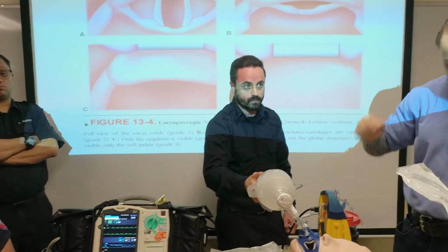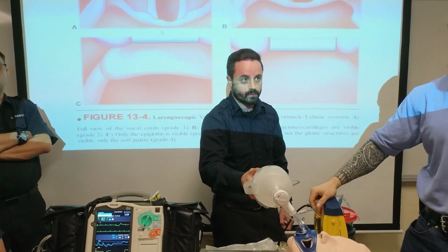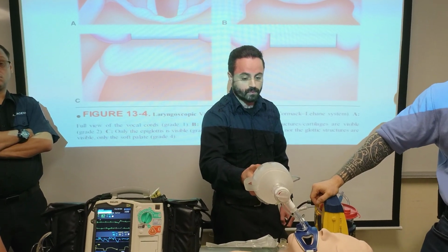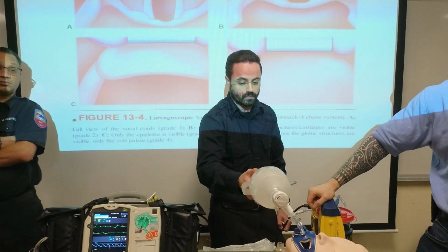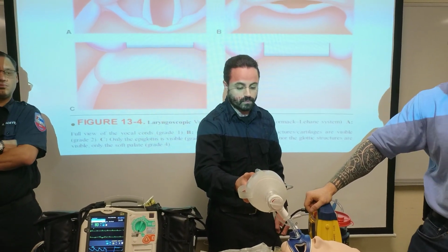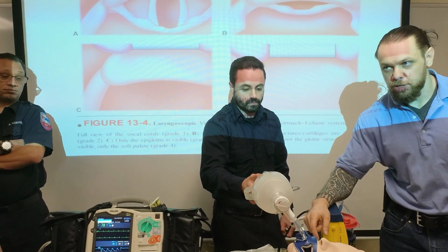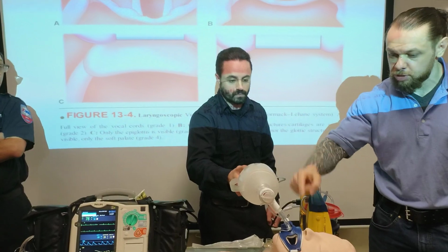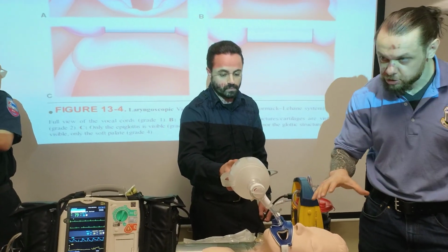When you move him from your stretcher to the hospital, make sure you reconfirm it and get the doctor or the nurse to witness it. Because what's going to happen is they're going to move the patient, the tube is going to be dislodged, and they're going to blame you. Exactly. When I was working as a paramedic, I did that all the time. You have a patient who you tube, or interfacility transport guys on the tube, and you do a transfer from your stretcher to theirs.